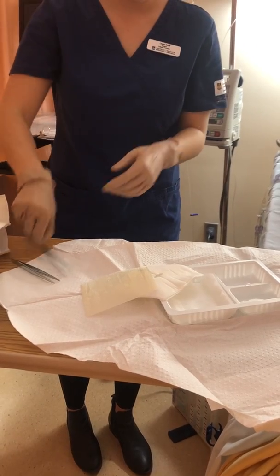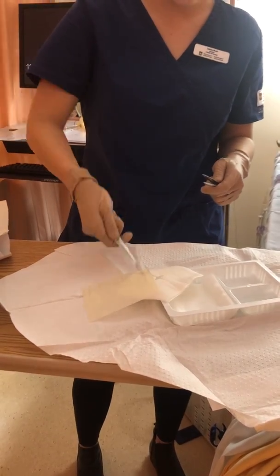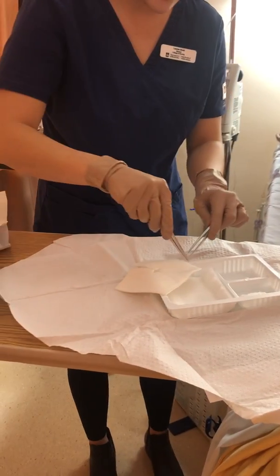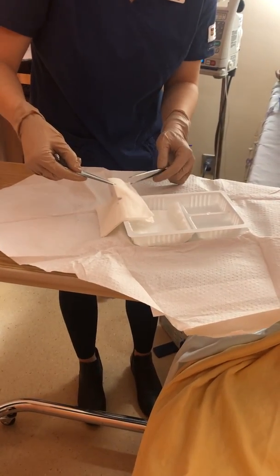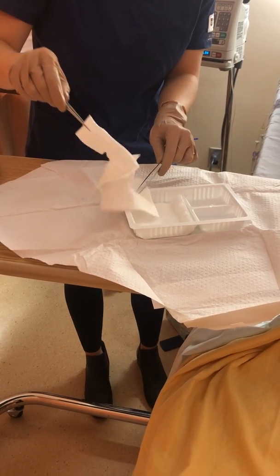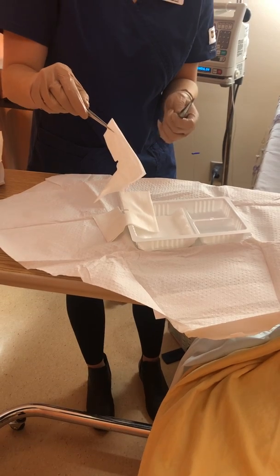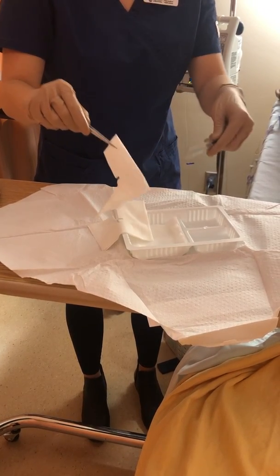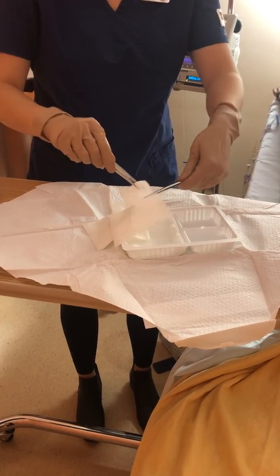So I'm going to go back to my forceps here for the drain sponges. Just going to move this garbage out of the way. I'm going to take one drain sponge here, and my hand touched there on my sterile tray, so my hands aren't sterile anymore, but I know that this part of my sterile field is also no longer sterile, so I'm going to make sure not to touch anything I want to keep sterile in that area.